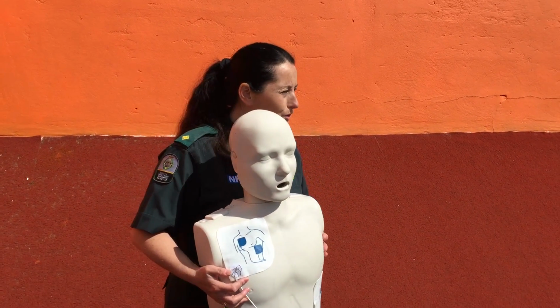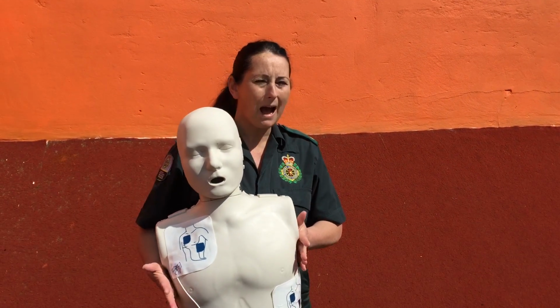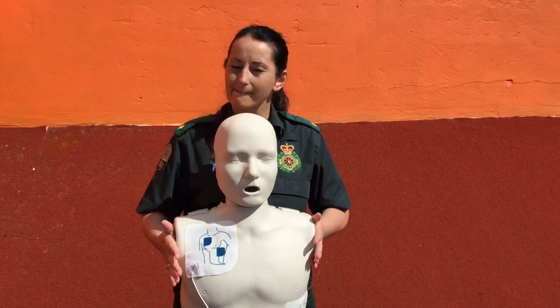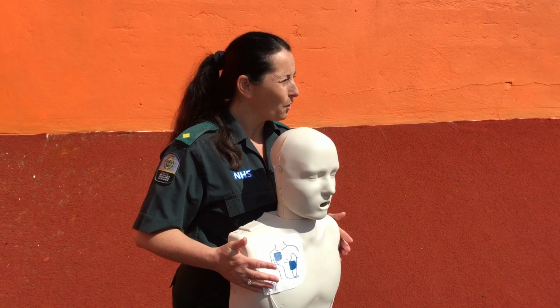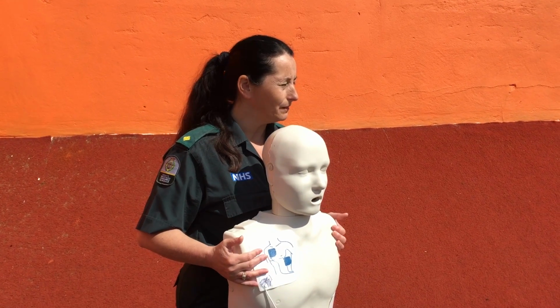With a child, it's from 1 to 8. Now the pads are sited differently for a child. Does anybody know where? They're not both on the same side. They are opposite.